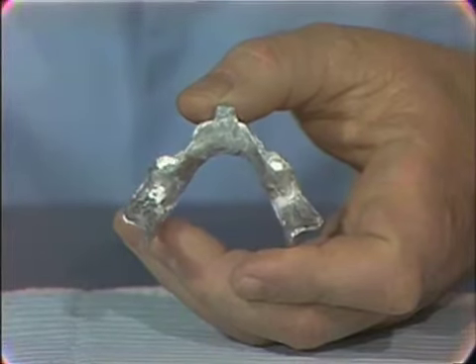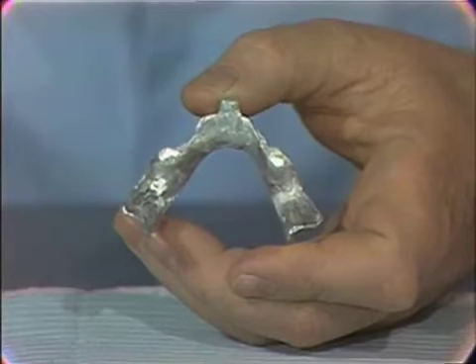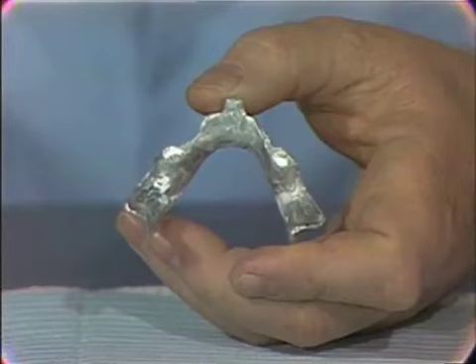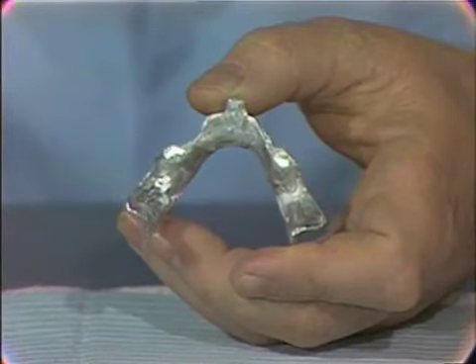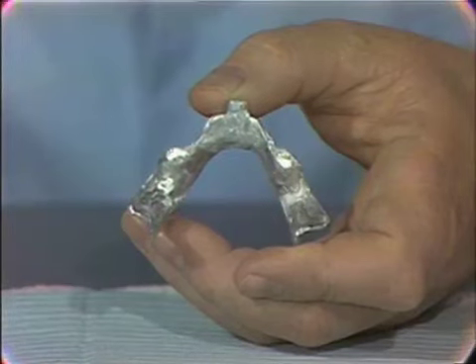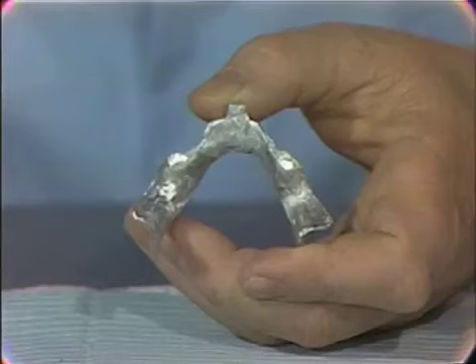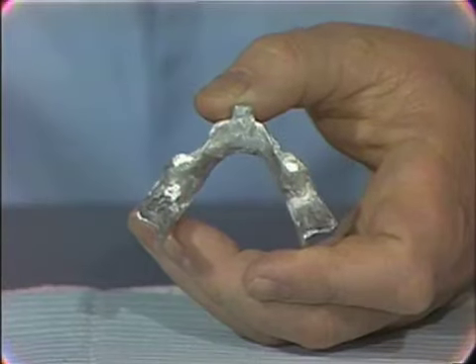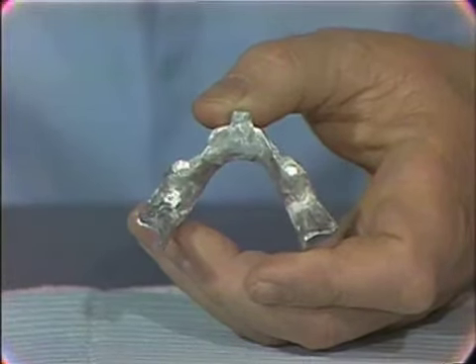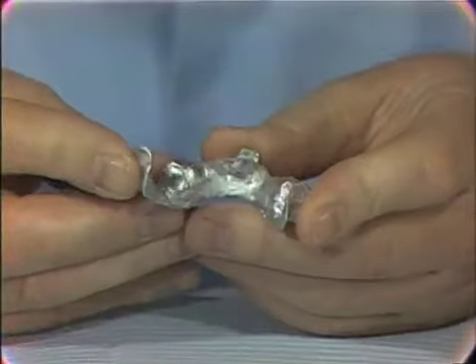The tray should also give support to the impression material after it's set, so we can place it back into the mouth and check the accuracy and the stability of the impression. So the impression tray gives support to the impression material. The impression material takes the impression. The tray should not interfere. In order to give support, the tray must be rigid. It should not flex. It should give adequate support.